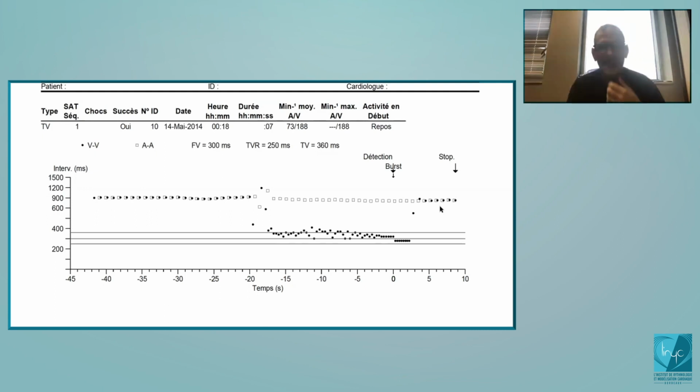So remember, the PR logic analyzes 6 parameters. One of these parameters is the difference between the ventricular rate and the atrial rate. If the ventricular rate is considered as faster than the atrial rate, so the point here is that before your counter is full, you will analyze the last 10 cycles at the level of the ventricle, the last 10 cycles at the level of the atrial.